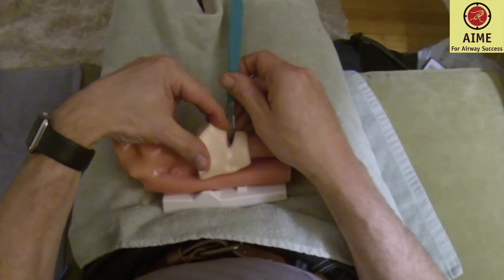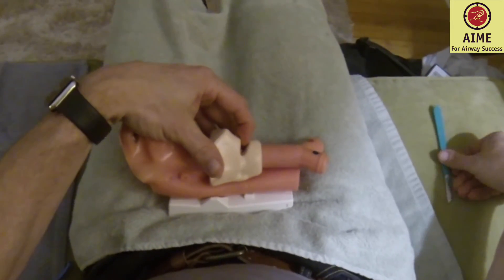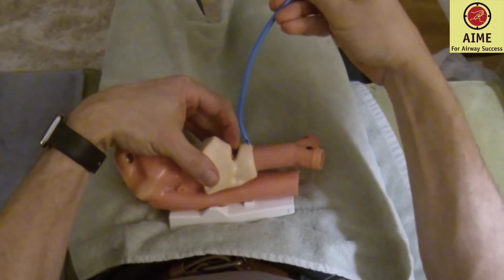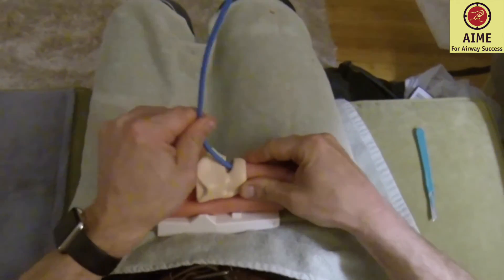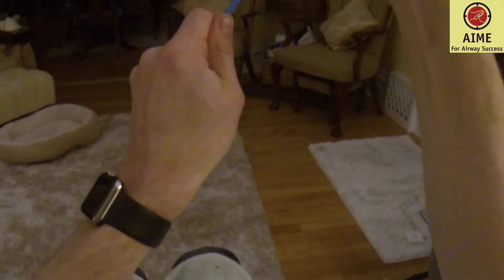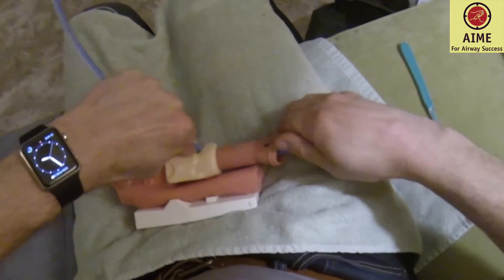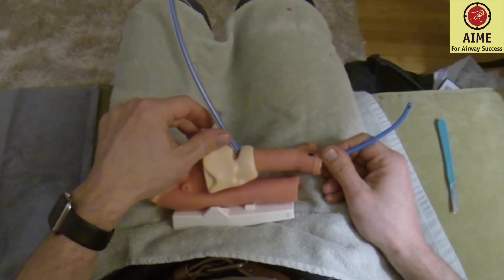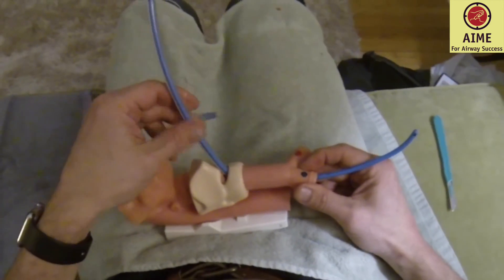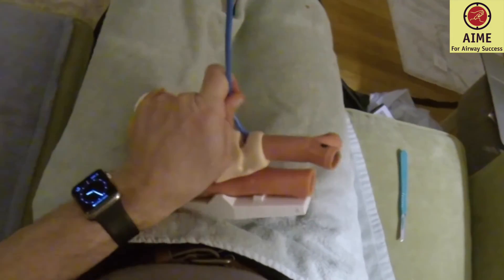This is why it's important to have the sharp part of the blade directed down — as the blade comes out, your finger drops into the space. Then the finger retreats enough that you can put the bougie in just alongside it. It goes down hopefully fairly easily, then place the endotracheal tube as before. That's the hybrid scalpel-to-finger-dilating technique, bougie-assisted cricothyroidotomy. It will work if you need it, and that's all she wrote.